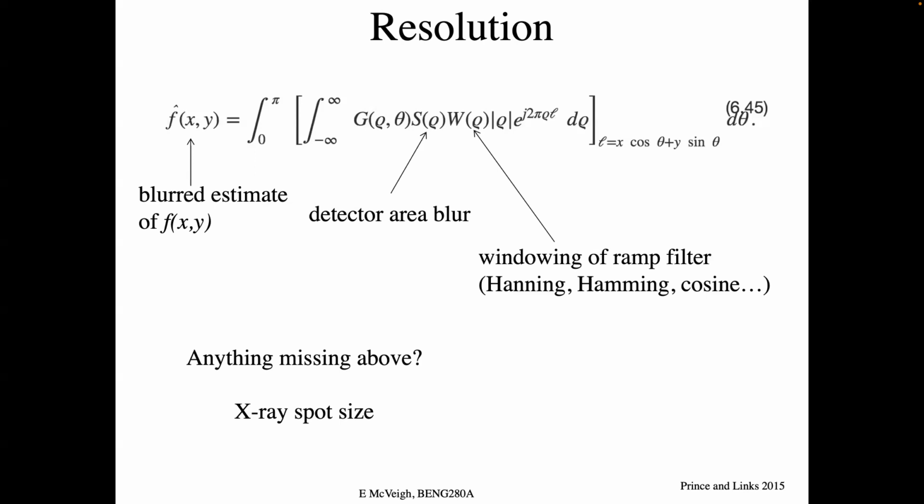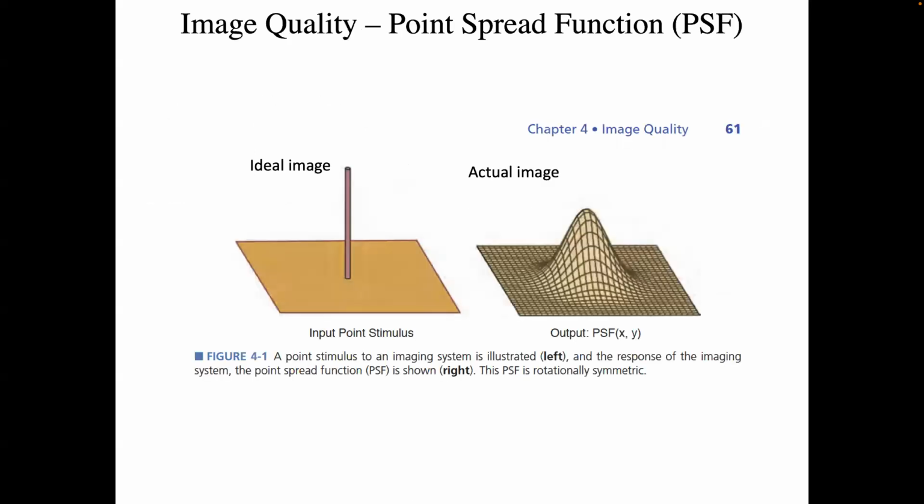And the way this is usually simulated, if you're writing a simulation of a CT scanner, you will just take the rectangle that is your source and divide it up into sourcelets. So you'll have 16 different sources, make 16 different pictures and add them up. And that's how you simulate that, right? And so that's the other thing that will cause blurring, is the spot size.